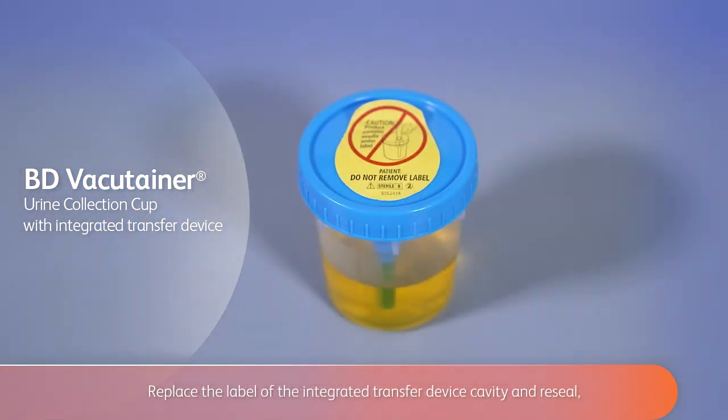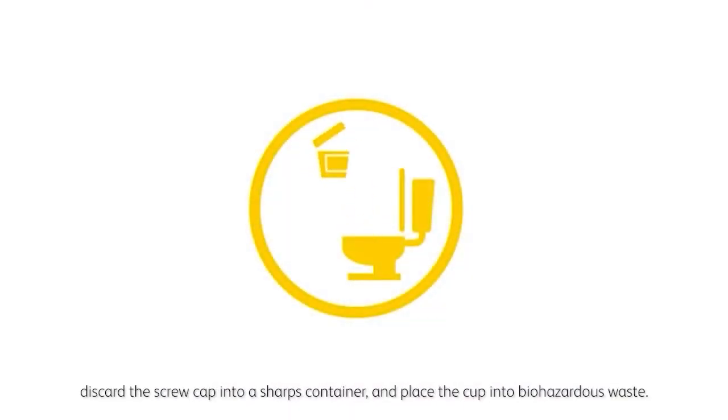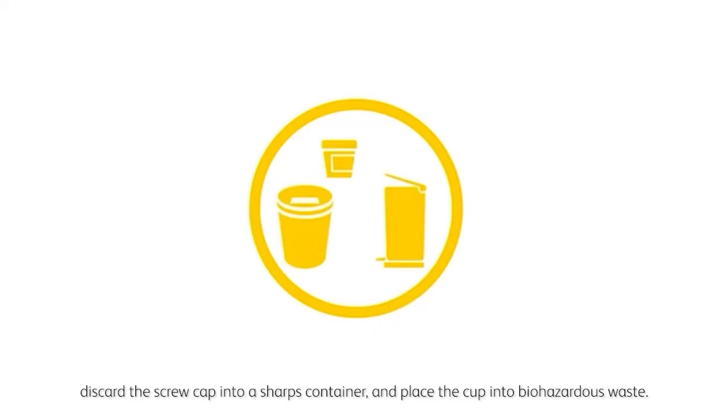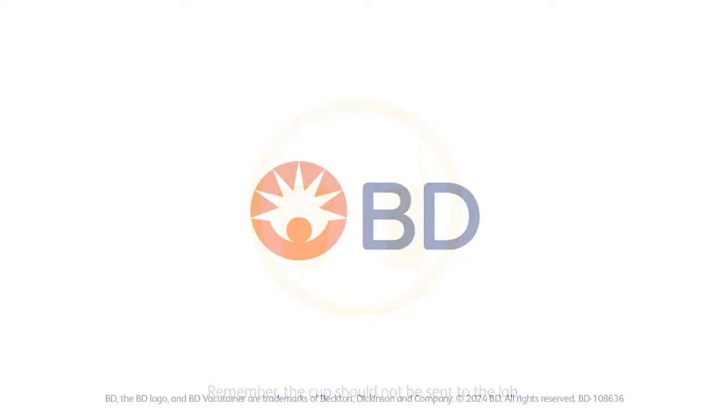Replace the label of the integrated transfer device cavity and reseal, using caution to avoid contact with the needle. Dispose of urine according to your facility's procedure. Discard the screw cap into a sharps container and place the cup into biohazardous waste. Remember, the cup should not be sent to the lab.